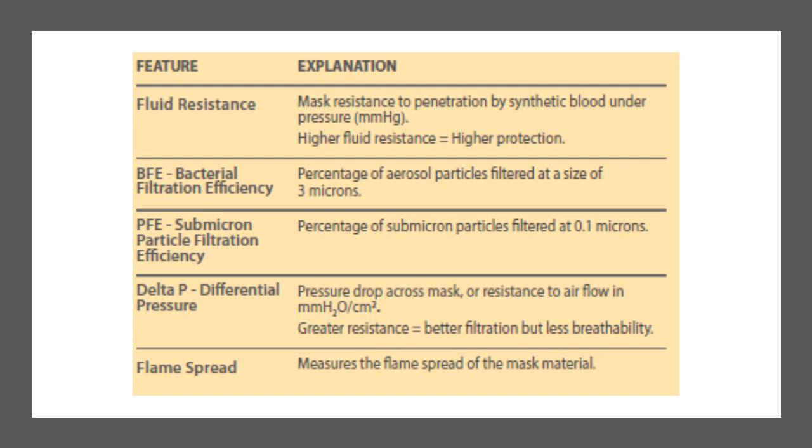So fluid resistance, bacterial filtration efficiency, and the particle filtration efficiency are the three things which you need to look at. Remaining two are not related to the contamination by the bacteria or the viruses.